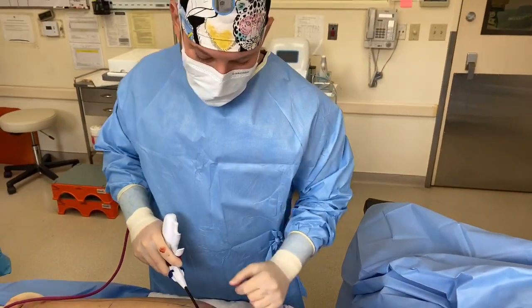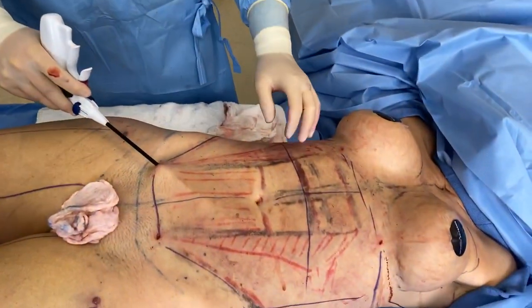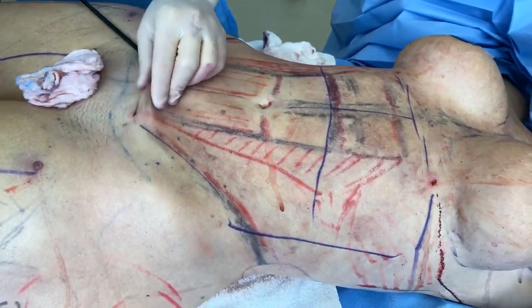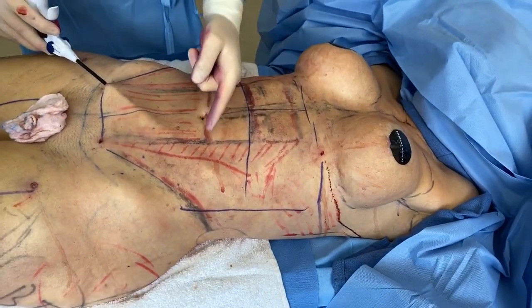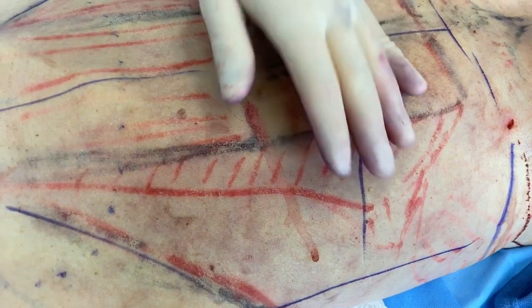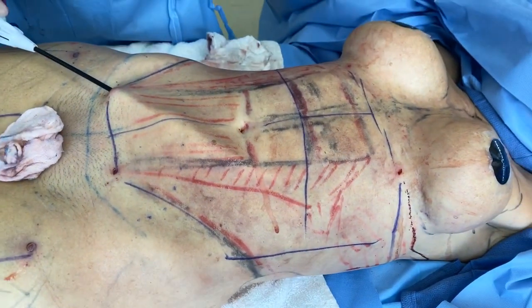We're now doing the internal heating portion of our surgery. Remember, we're going to be doing a mini tuck, so all this part is going to be removed. We're heating everything above, to the sides, and in the back. You can see this is internal radiofrequency helium plasma — it allows for a wide area. I'm going to show you guys how strong this plasma is.